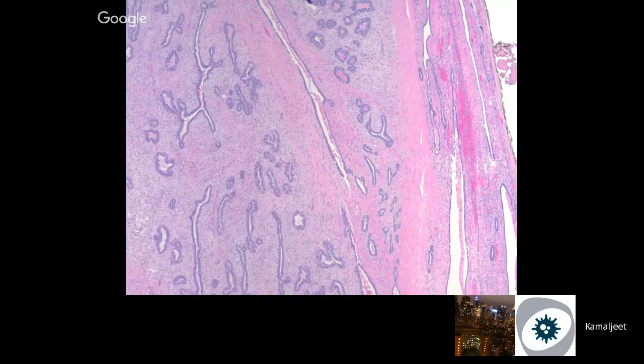This is a picture from a juvenile fibroadenoma, because this comes into the picture whenever you're dealing with a fibroepithelial lesion with very cellular stroma. So the differential is cellular fibroadenoma or a juvenile fibroadenoma. With juvenile fibroadenoma, everything goes hand in hand. You will see the epithelial component is also proliferating. You can actually appreciate it in this picture. The stroma is very cellular, and it's evenly cellular. So that would make it sort of a juvenile fibroadenoma.